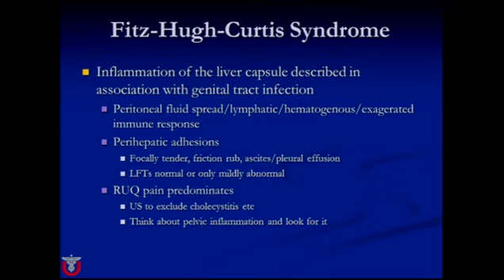And of course, in patients with preeclamptic toxemia in their pregnancy, they are at risk for delayed subcapsular hematomas or spontaneous rupture of the liver. So if you see a postpartum patient who presents primarily with right upper quadrant pain, remember always to check the pelvis as a source of inflammation.